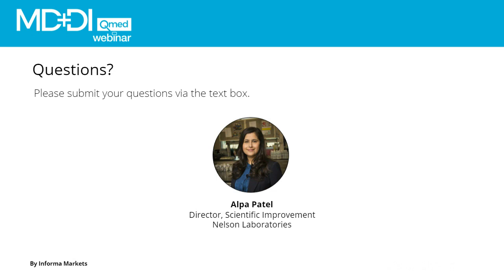Okay, that's a good question. The difference between disinfection and sterilization is the criticality of the device, which you'll hear tomorrow. If you are using semi-critical devices, they are subjected to disinfection. These are devices that come in contact with mucous membranes. But if they can be sterilized, they should be sterilized. So the difference is, can the devices be sterilized? If they can, yes. If they cannot be sterilized, then you have that mode of disinfection.